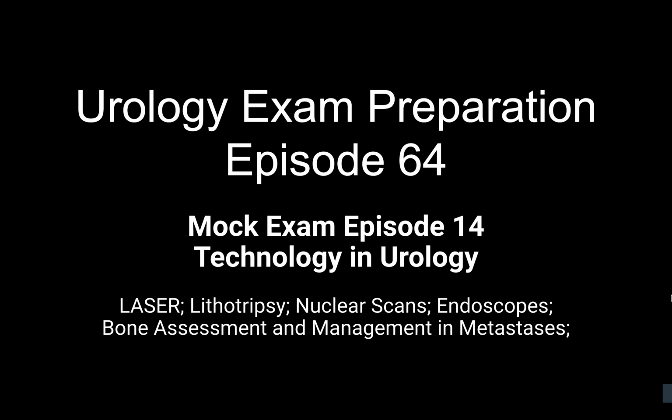Then for the same patient, if you have to do the indirect micturating cystourethrogram, how will you convert the same investigation? For indirect micturating cystourethrogram, I would ensure the radionuclide agent gets to the bladder for the cystogram, and then ask the patient to pass urine in front of the camera to see if there is any reflux back into the kidney. Okay, good. We'll stop there.